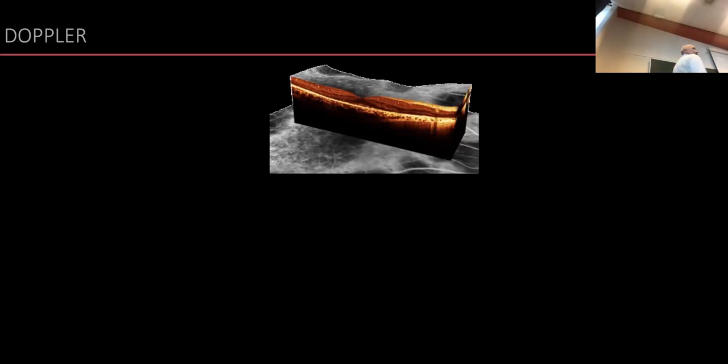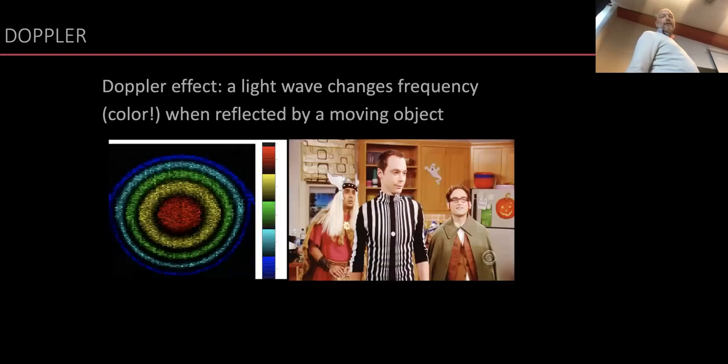Maybe he also explained that it's possible to look at things like the Doppler signal from OCT data. Beautiful. This is an example of how that looks. I'm not sure if he already showed that. But suddenly, besides just beautiful images, you can analyze Doppler shifts in your OCT data, which are related to the moving red blood cells.